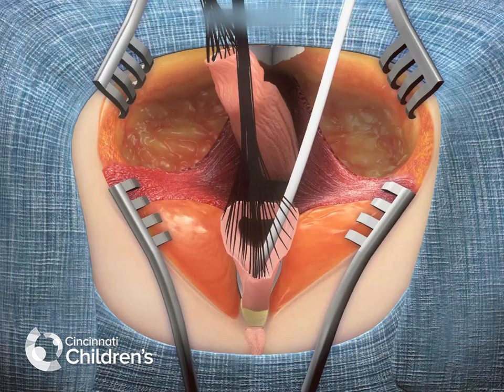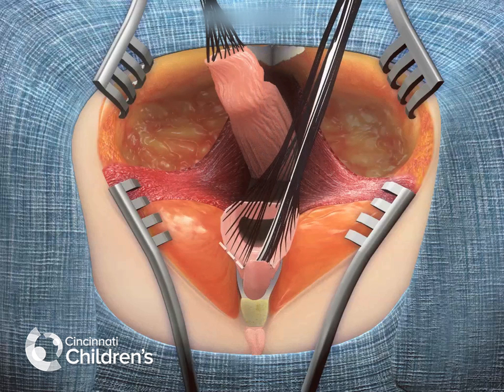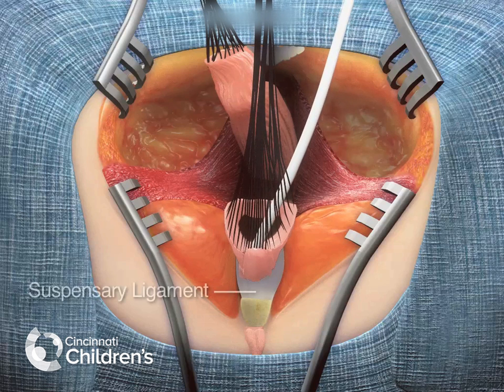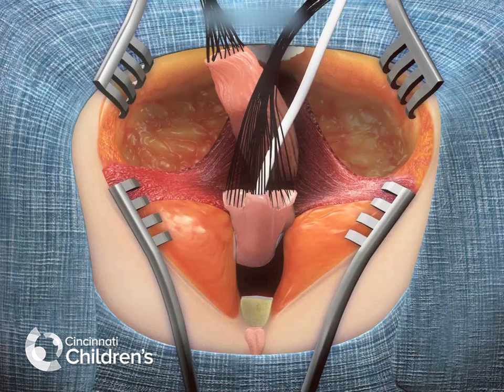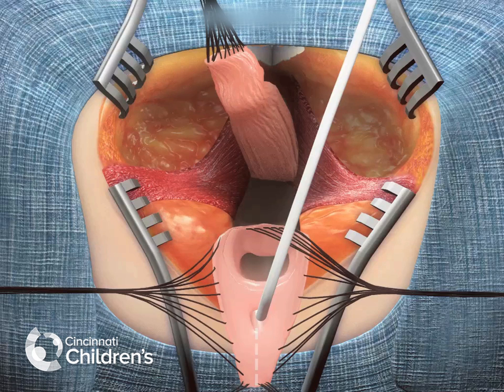As seen here, with sequential dissection, this structure can be completely freed from the pubis and from its lateral attachments. At this point, the suspensory ligaments are exposed, an avascular plane that can also be dissected, and division of these suspensory ligaments often allows these structures to be moved towards the perineum between 2 and 3 centimeters. At this point, the previous common channel is divided in the midline.